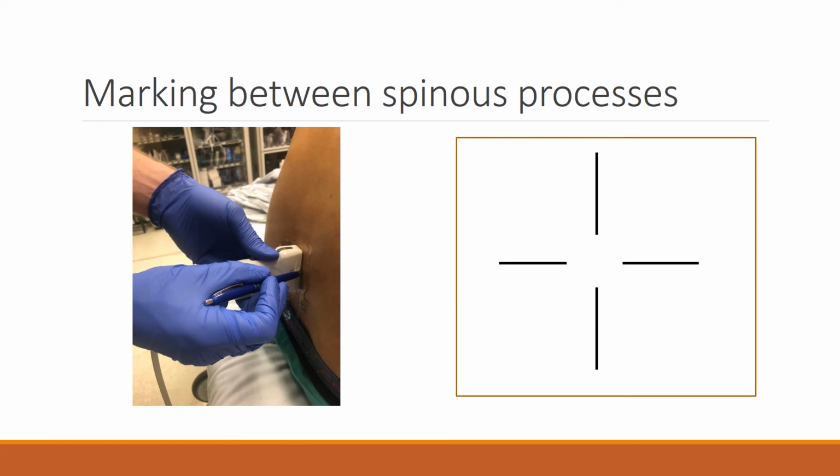Perform your lumbar puncture as normal using this as your guide, and it will make your positioning much easier.